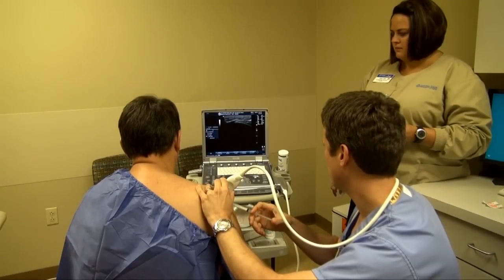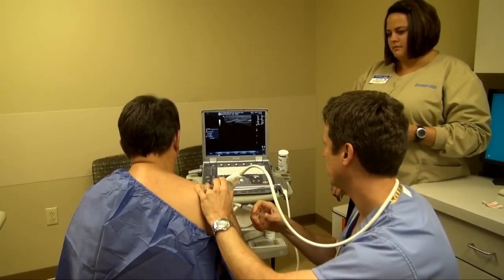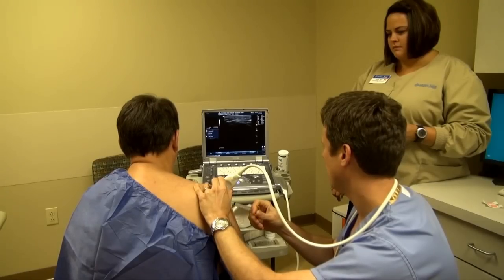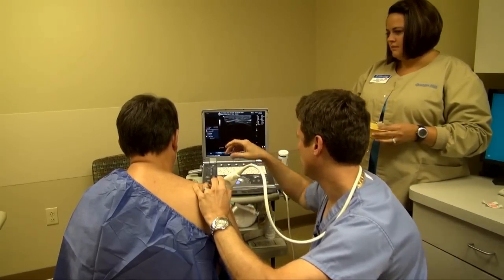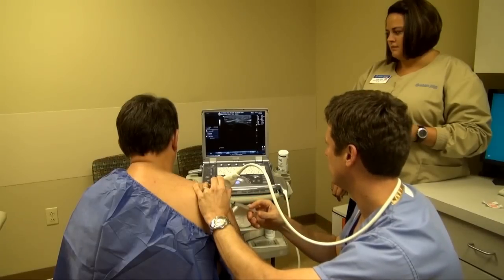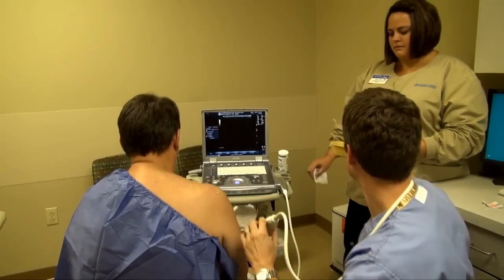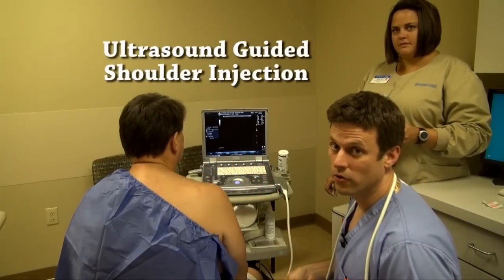I'm going to have Aaron take a picture of that. And now you may feel some pressure, fullness. And now if you watch the needle right here, you're going to see the needle come out. And that's it — that was an ultrasound guided shoulder injection.